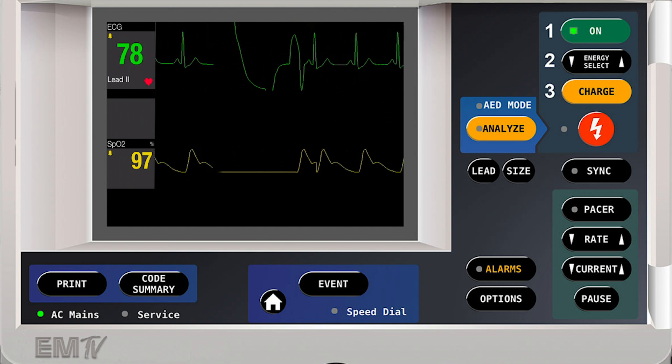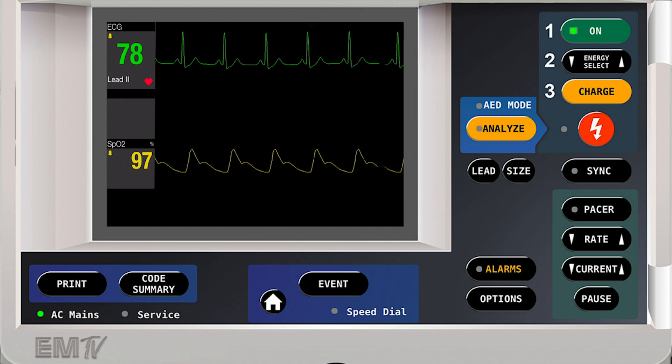And just like that, we've successfully converted a patient out of an unstable VTAC back into normal sinus rhythm.